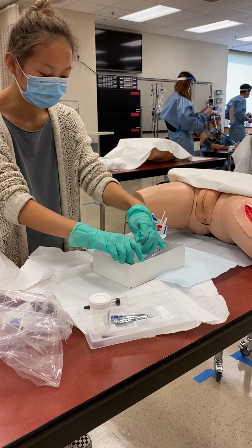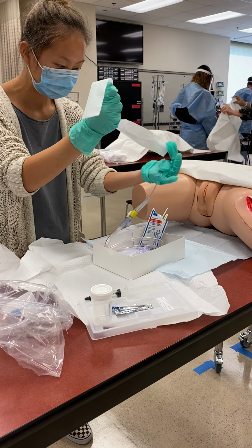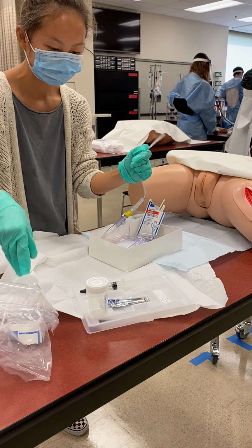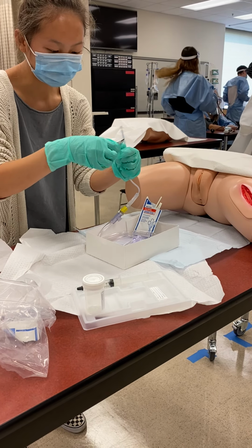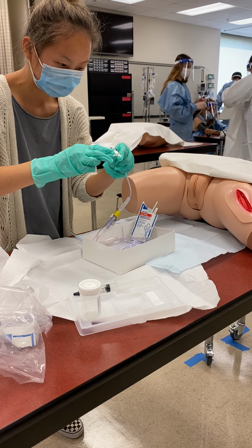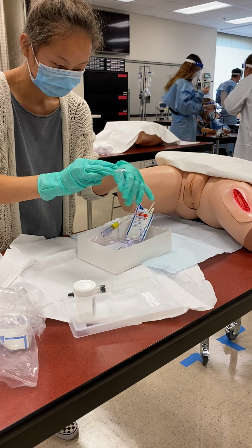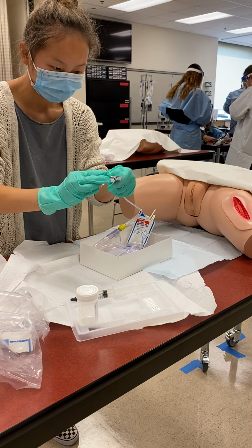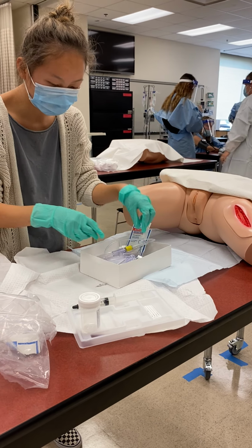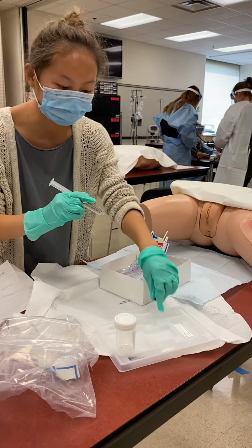And then we want to make sure we get this plastic wrapping off of our catheter. And we can discard this piece over here. And we want to make sure that this is lubed up and ready to go. And so we can leave it in the packet for right now like this. And then another thing too is we want to attach our 10 milliliter syringe to our catheter before we become unsterile.